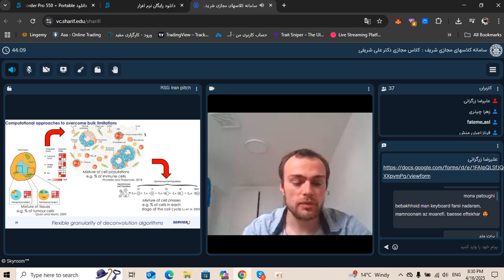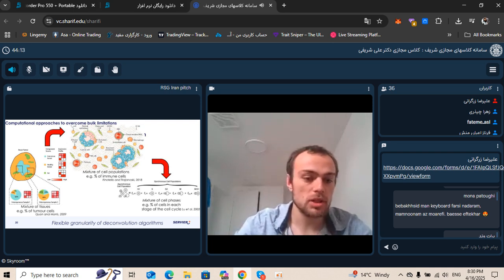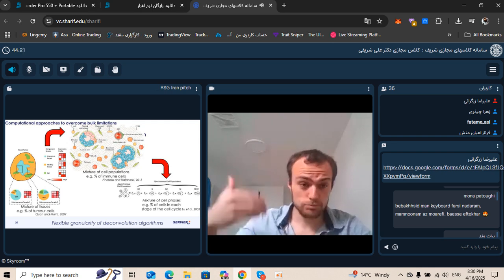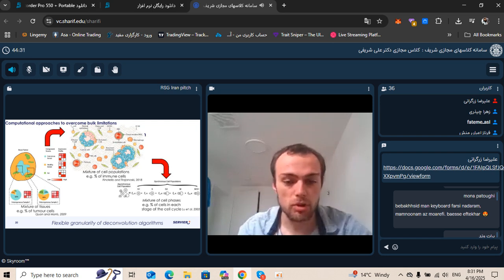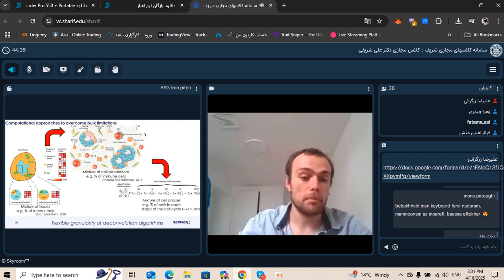And usually what this kind of algorithm wants to infer is the level of contamination in a sample, and to be even more specific, the proportion of tumoral cells in a tumoral sample. Because usually, especially in solid tumors, when you retrieve and extract your tumor using, for example, a biopsy, you will notice an intertwined blend of healthy and tumoral tissues.